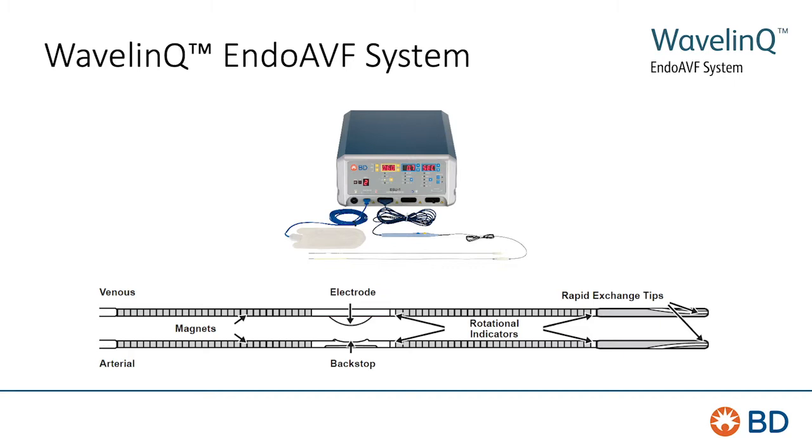Once properly aligned, you activate the device and you cut from the electrode side, from the venous side, into the arterial side to create your AV fistula. There's no magic to this. It's an RF system creating heat energy to burn a hole from the vein into the arterial side, making a fistula. And a lot of people will wonder, well, how come you don't get frank extravasation?